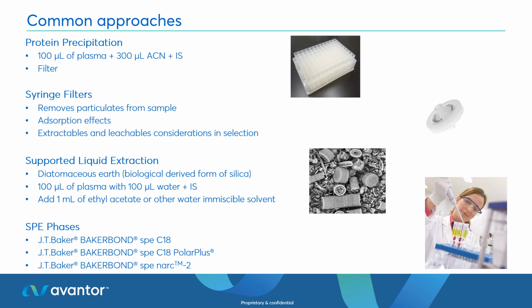The final form that I'm going to mention as a common approach is the use of solid phase extraction. And there are a variety of different solid phase extraction cartridges available. I've just highlighted some of the silica-based ones from JT Baker Bond. In the next section, we will go through in some detail some of the approaches that can be used to optimize a solid phase extraction method.